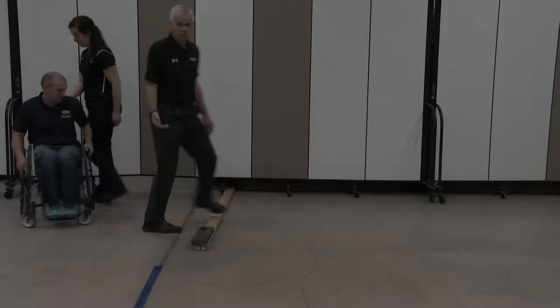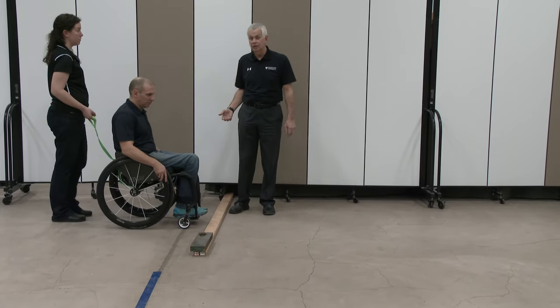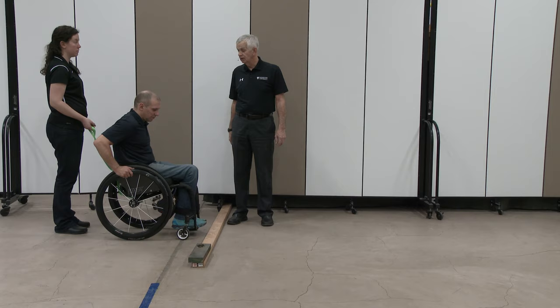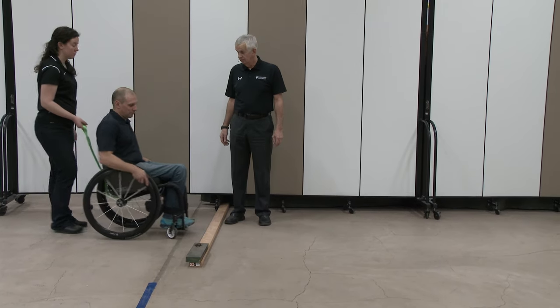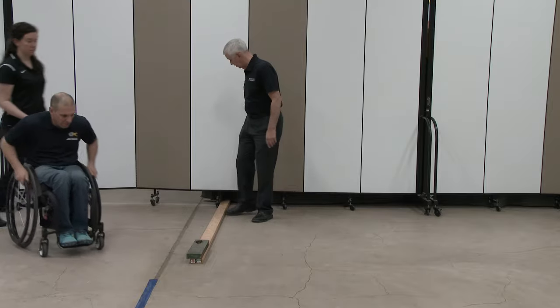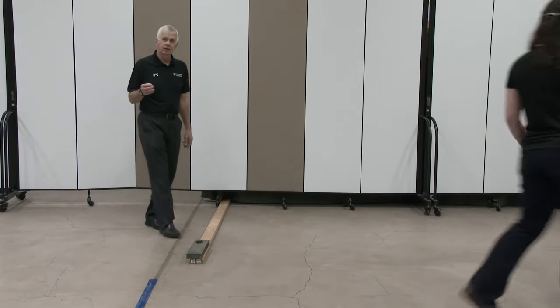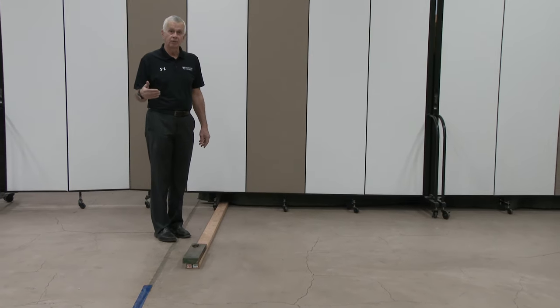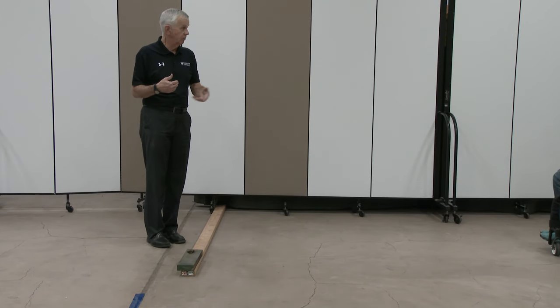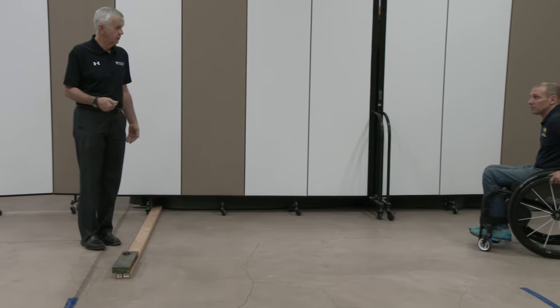That would be adequate for the wheelchair skills test, but for training purposes we like to have people do it in a moving approach as well, called the momentum approach. We have you do it in the same direction as before, so instead of just pop and lean, now we have coast, pop, and lean. The coast allows your hands to be in the correct position when you reach the obstacle.